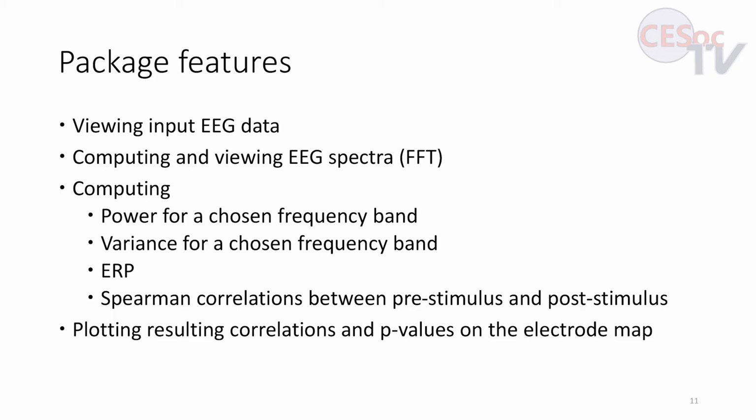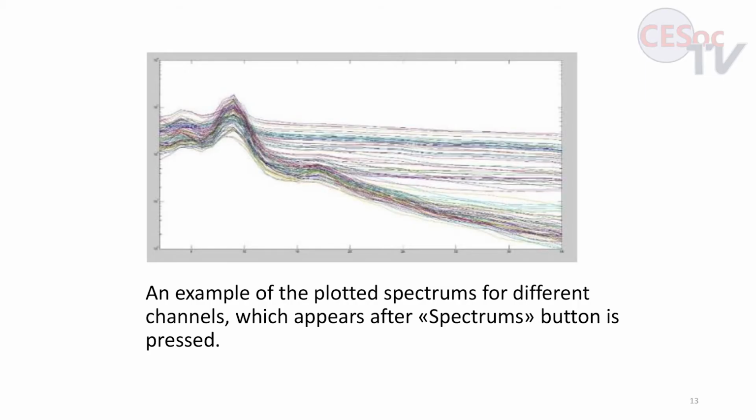And it can also plot resulting correlations on an electrode map, which really helps to visualize which part of the scalp contributed more.